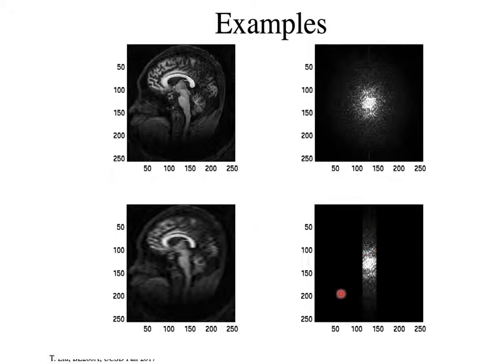When we look at the image that results, the Fourier transform of this, it looks like this, right? And as you might expect, it's very blurred in this direction, because we don't have raw data out here at the high values in K-space in this direction. So when I look at edges, they're very blurred when I look at the profile of the edge this way compared to up here.